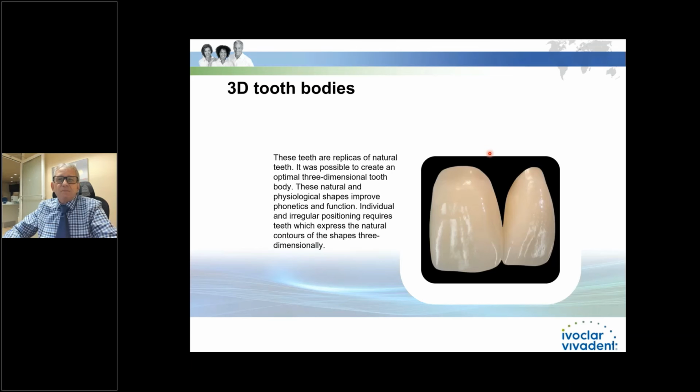Here's what we did. We turned around, and this is a normal tooth, and you can see what I was talking about here. I'd have to wax all the way up to here. But what we did, we close that up, and now I can make my interdental papilla here. So it's more natural. And I don't have that big gray area that's going back and forth here.